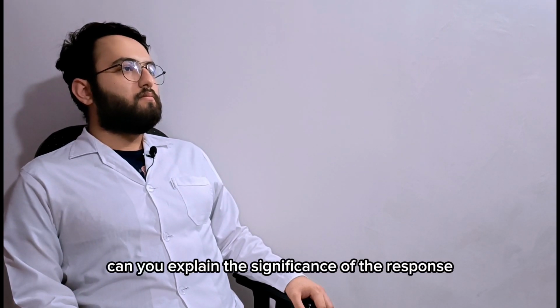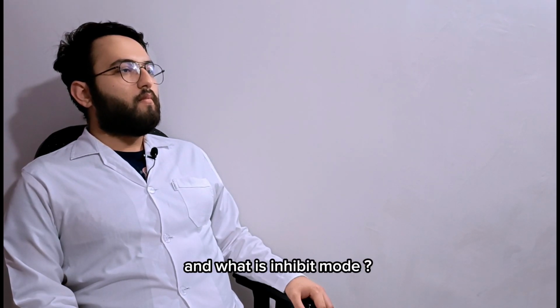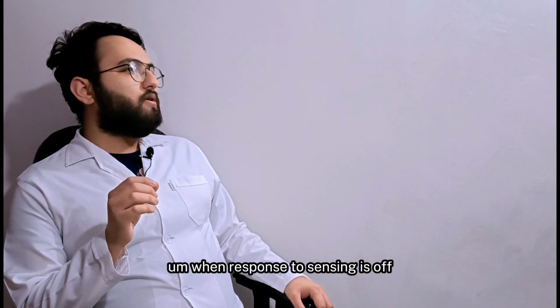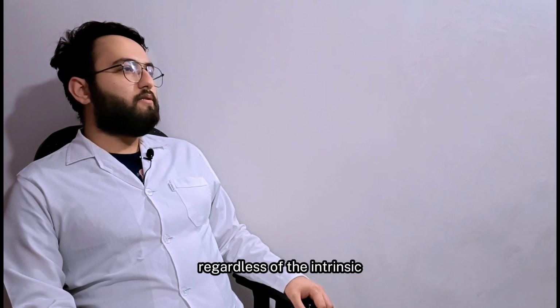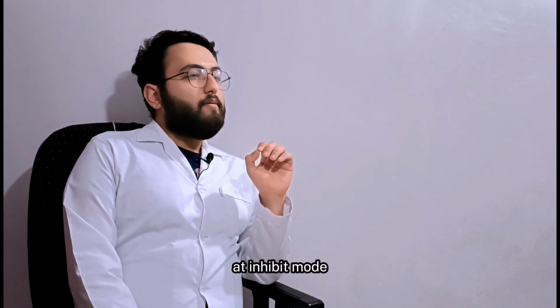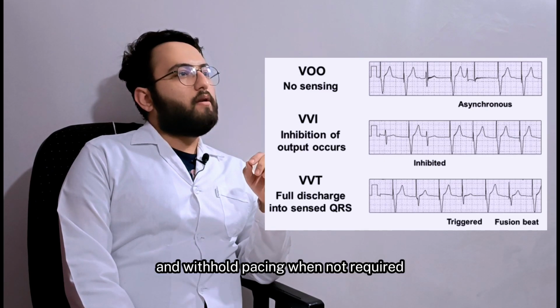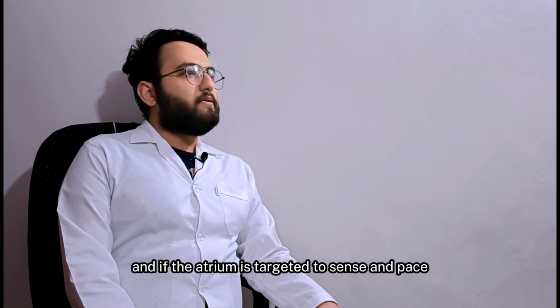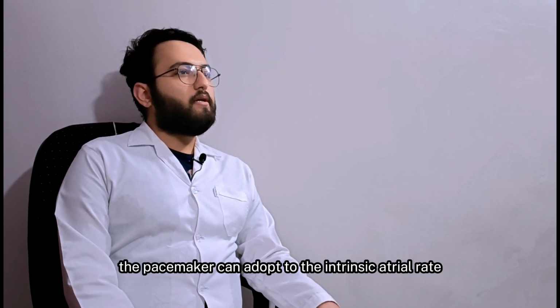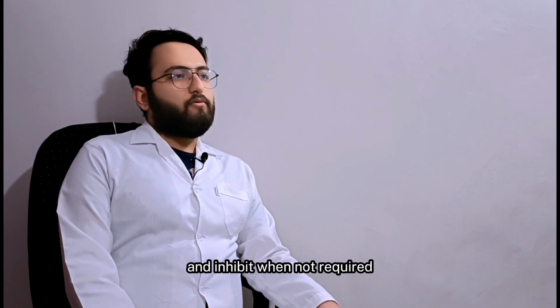Moving on, can you explain the significance of the response to sensing being off in pacemakers, and what is inhibit mode? When response to sensing is off, the pacemaker paces at a programmed rate regardless of the intrinsic electrical activity of the heart. And to your second question, in inhibit mode, the pacemaker can sense the electrical activity and withhold pacing when not required. And if the atrium is targeted to sense and pace, the pacemaker can adapt to the intrinsic atrial rate and should be able to pace when needed and inhibit when not required.